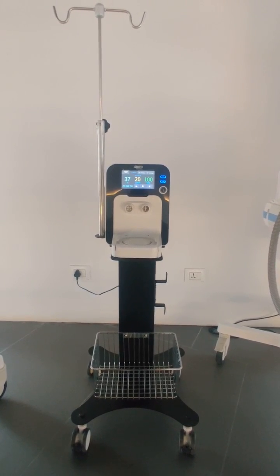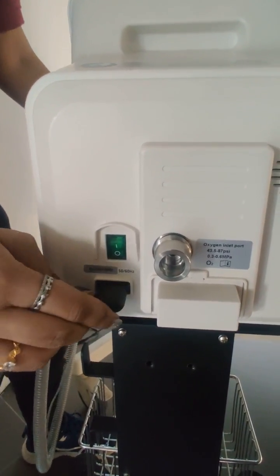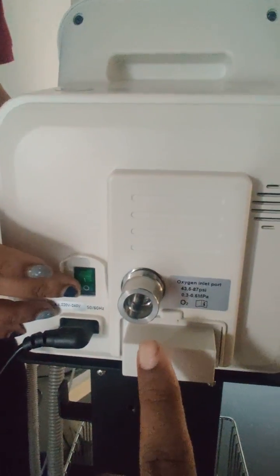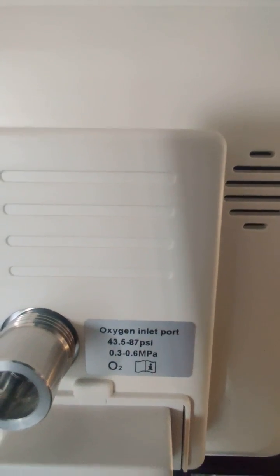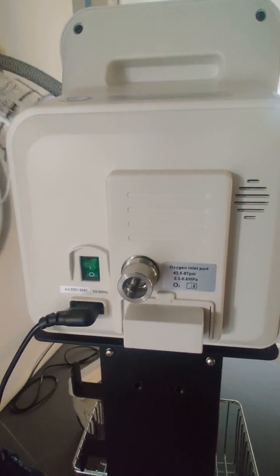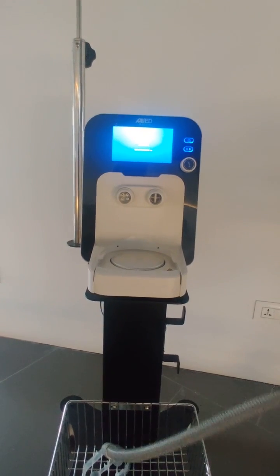Starting with the installation of this HFT device — on the rear side we connect the power cord to the main supply. There is also a port on the rear for connecting the oxygen source, with a rating from 43.5 to 87 PSI, which can come from a piped supply or cylinders.